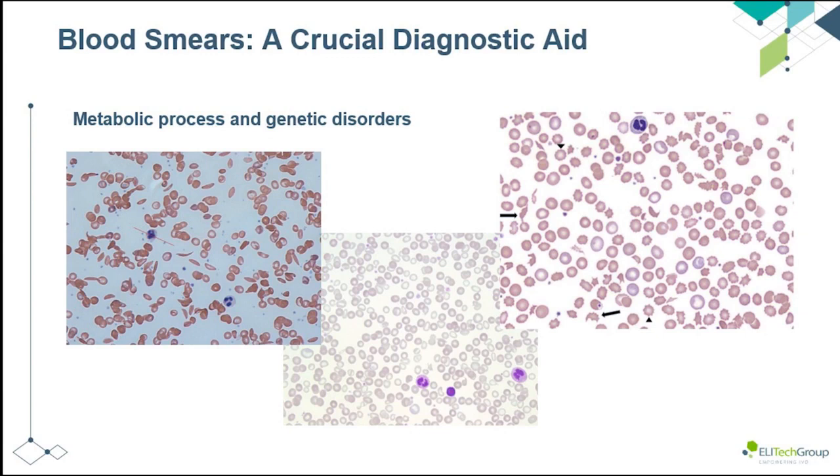And there's a whole bunch about the shape. There's spherocytes and dacrocytes, or teardrop cells, target cells, acanthocytes, which are spur cells, stomatocytes, and echinocytes. So all those just describe the shape of the red blood cells. And each of these characteristics is another clue to the clinician about what's happening in the patient.